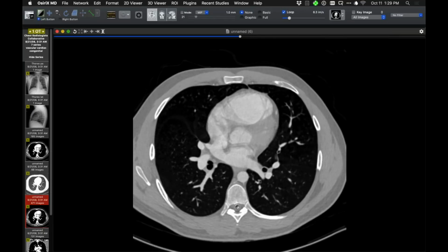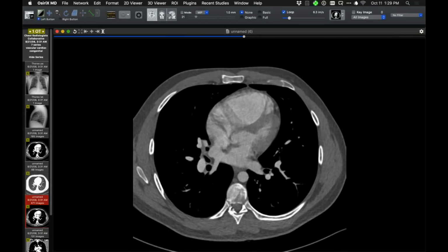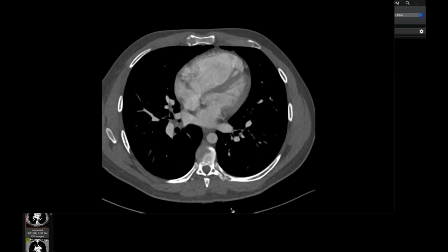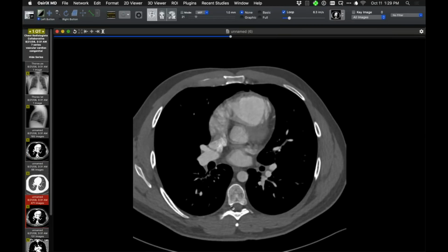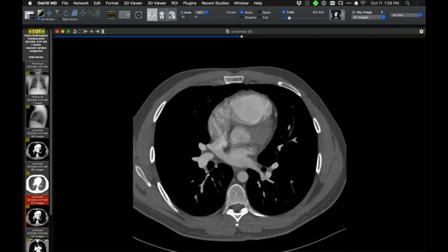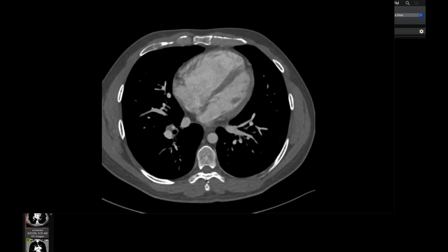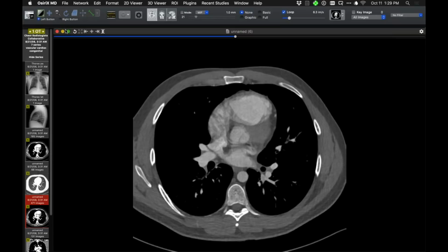And I hope you guys will agree with me, because if it isn't, I'm going to be embarrassed. Sure looks like it. Yeah, definitely. And right. And you can see that his RV is just huge. Yeah. So yeah, but just from the overcirculation, and that's always a reminder to just look and see if there's an undiagnosed shunt like that. Yep. Very good.